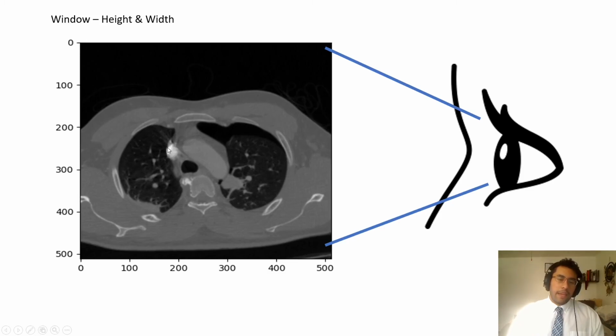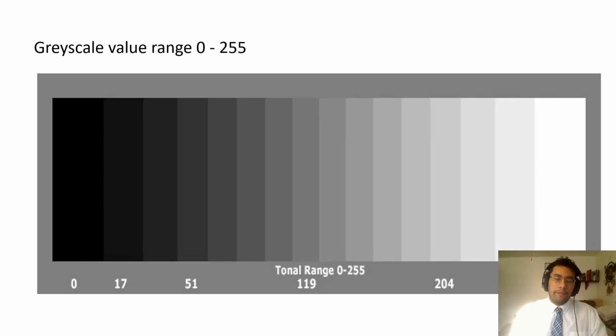Sometimes that's a pacemaker. These are two lungs. Your lungs are different sizes. I think your left ventricle is a little bit larger, if I remember right, or the right. Don't quote me on that. That could be a little bit wrong. And then we have this body cavity of the patient. And then air is even picked up on the outside. So these values are really important for doing computer vision and evaluating the data in the image itself.